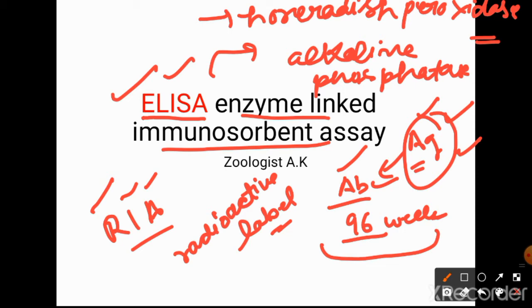So here the amount of product formed is proportional to the amount of enzyme present and inversely proportional to the amount of test antigen. And this enzyme activity between the substrate molecule and the enzyme that is labeled to the antigen molecules is measured through optical absorbance, but fluorescence or chemiluminescence techniques can also be used here.